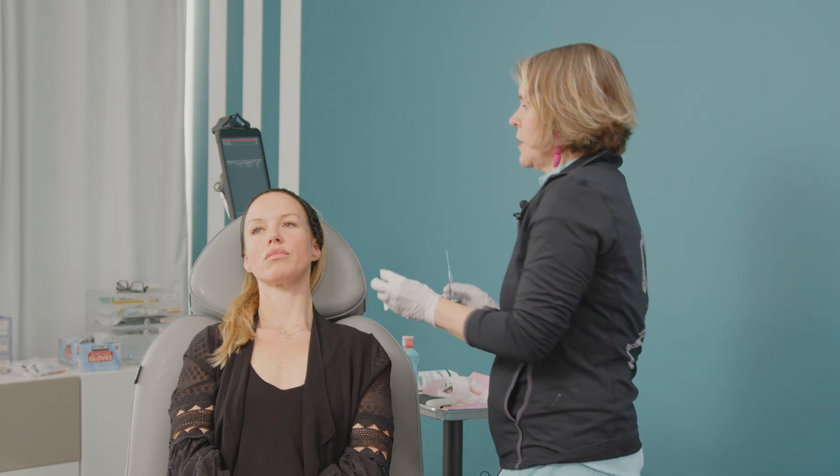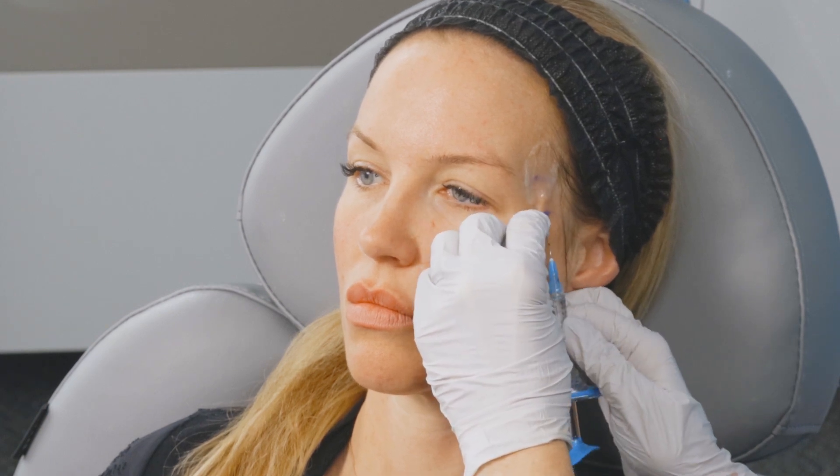Just a tiny little poke hole — we don't need to be aggressive with our needle, we don't need to shake it around, it's just a little tiny poke hole. Now we want to make sure our device is still on B-mode because we're going to be checking our depth. We want to make sure we're in layer 2 above that artery. Layer 2 is also a glide plane, so usually when you're in layer 2 it's really easy to move the cannula in and out — but I don't use that as a test. I have ultrasound to prove I'm in layer 2, and I can see that I'm going to be above the SMAS, and that's what I'm going to check right now.